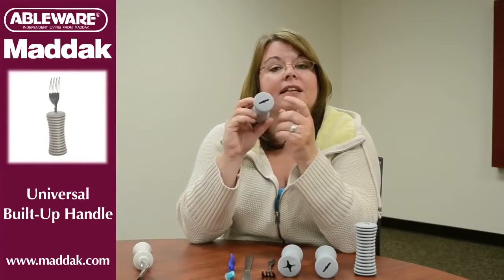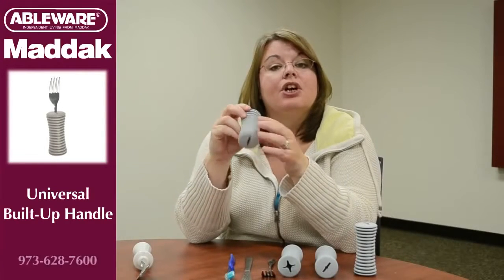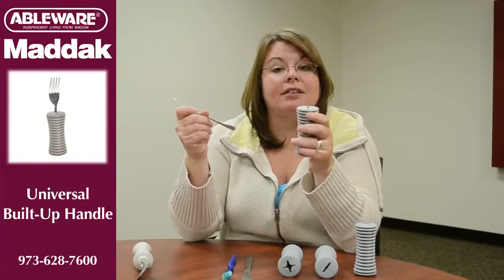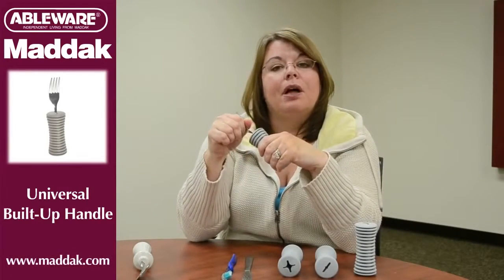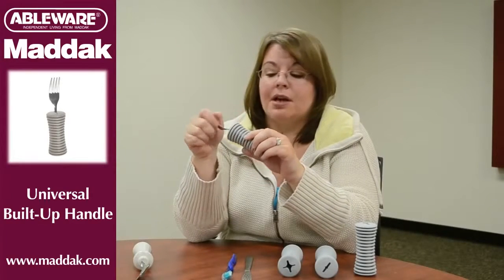The universal handle has a slit on one end and a star shape on the other end. To use the handle with a fork or a spoon, you just take the utensil, slide its handle through the slit — it's going to poke out the other end — then twist it and pull up to lock it into place.